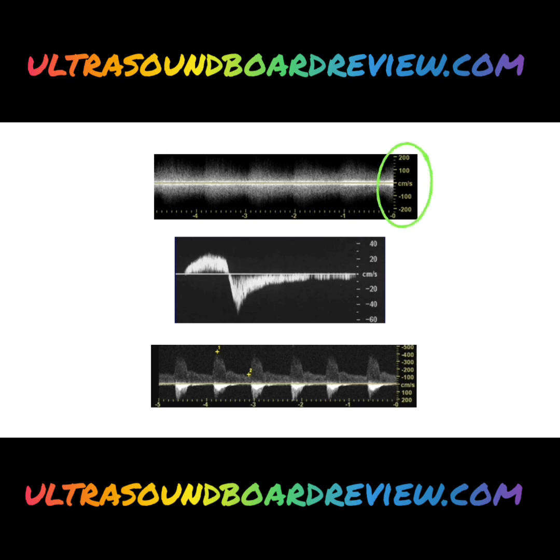So here is where we're going to find the positive or negative, the towards or away. Positive is towards, negative is away, right? So here we have our positive numbers on the top of the baseline. So all this flow on top of the baseline is going towards the transducer. Our negative numbers are on the bottom of the baseline. So all of that flow below the baseline is going away.